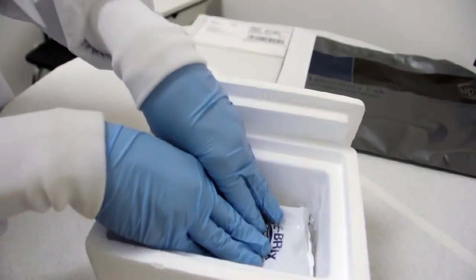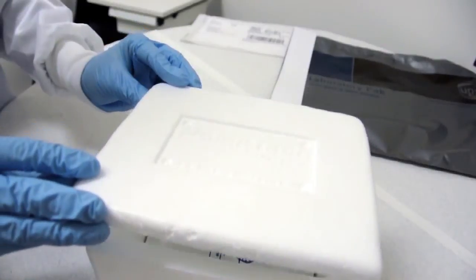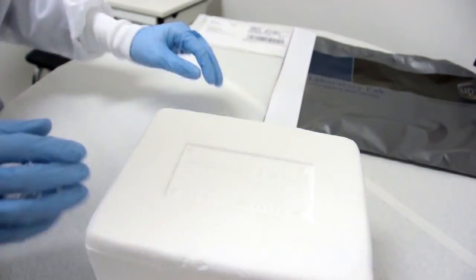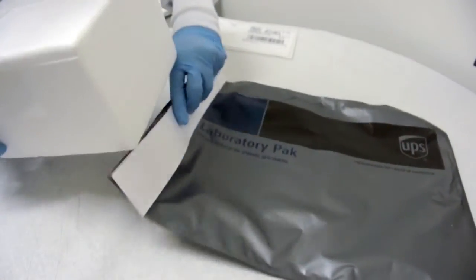Place 1 or more frozen ice packs into the styrofoam box based on package size and projected weather conditions. Place the styrofoam lid onto the box, then place the box into the provided UPS shipping bag and seal.